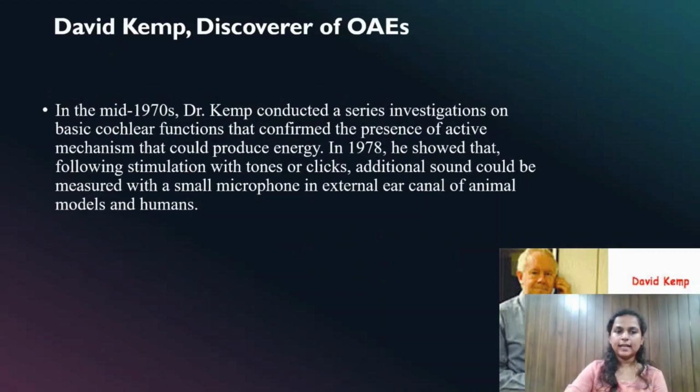David Kemp, discoverer of OAEs, in the mid-1970s conducted a series of investigations on basic cochlear functions that confirmed the presence of an active mechanism that could produce energy. In 1978, he showed that following stimulation with tones or clicks, additional sound could be measured with a small microphone in the external ear canal of animal models and humans.